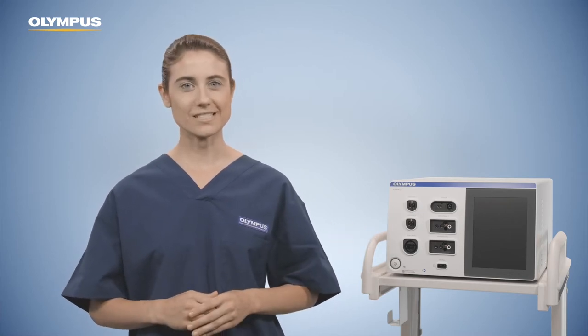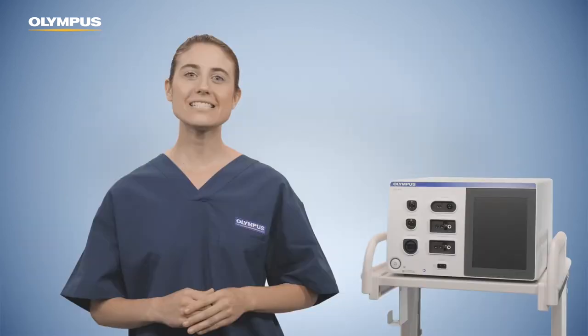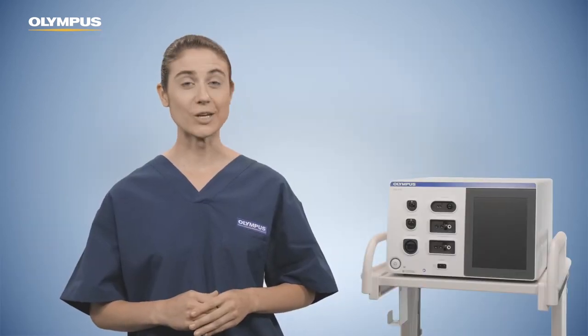Welcome to the ESG 410 In-Service video. In conjunction with accessories and instruments, the electrosurgical generator, ESG 410, is intended for cutting and coagulation in open, laparoscopic and endoscopic surgery.